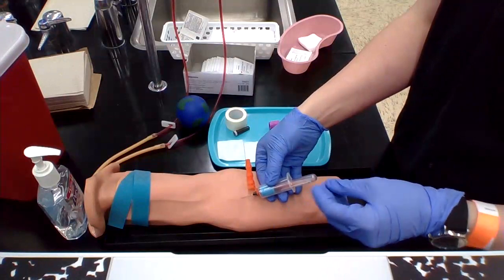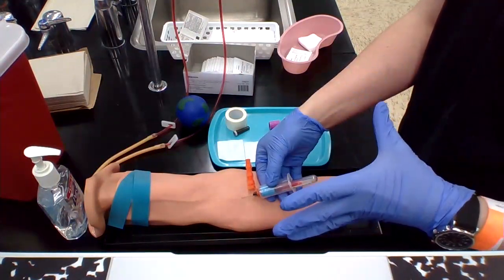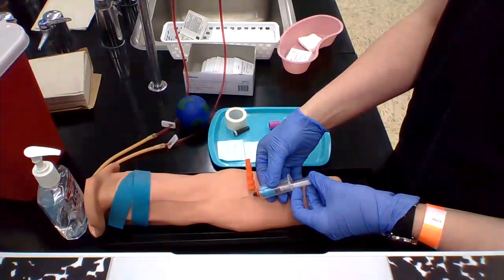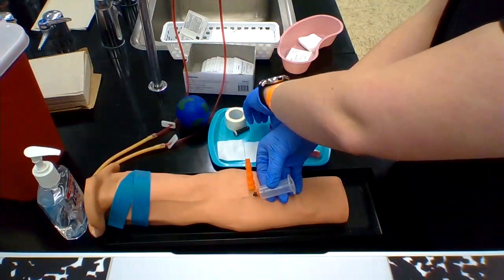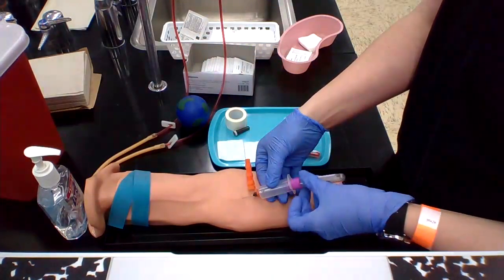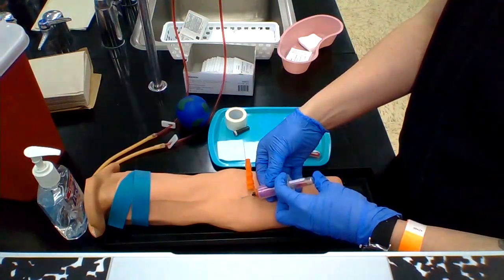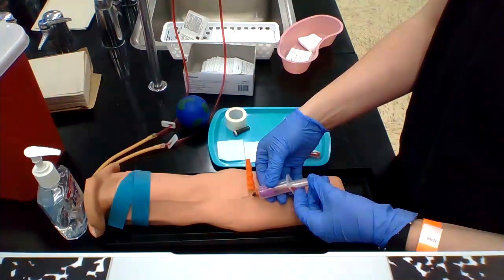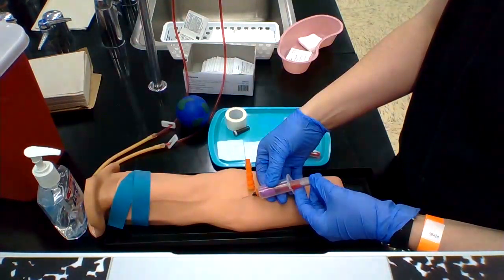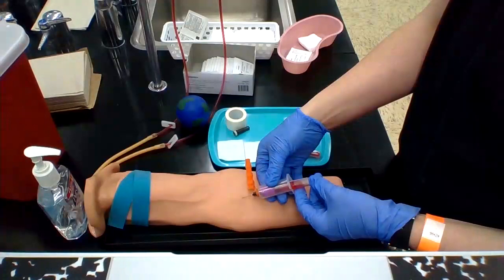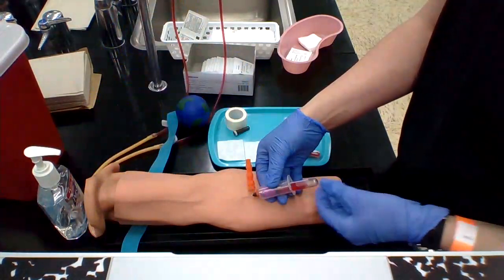If you don't hit your vein, you can go in a little bit or you can pull back a little bit. Don't dig around. If you don't hit the vein, pull out. Start again. Start on the other arm if you still can't get it after the second arm. Another phlebotomist or other staff member needs to perform the venipuncture. You shouldn't be poking people more than twice.